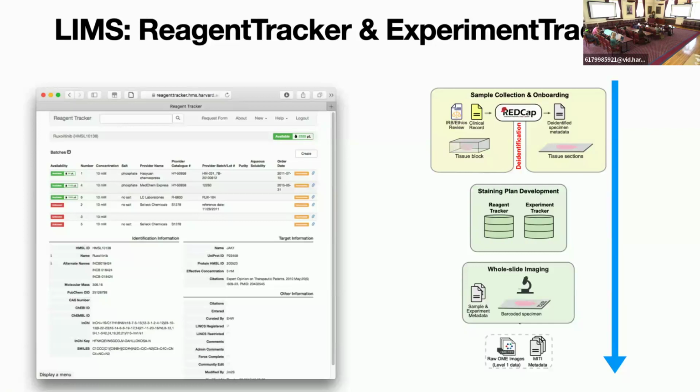So when you're doing an experiment with 60 little vials of colorless liquid, pipetting them and sloshing them on your slides, you want to make sure you've got the right ones from the freezer and that you've got the right ones in front of you and that you decided to pull the right ones in the first place.